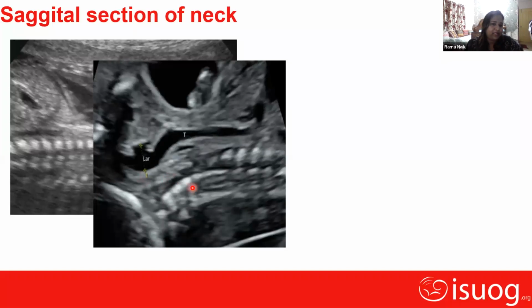Now, for example, in this structure, this is the head part and this is the anterior posterior part. This is the chest here. So there may be some obstruction here. That's why the larynx is so prominently seen and the trachea is so nicely seen here.